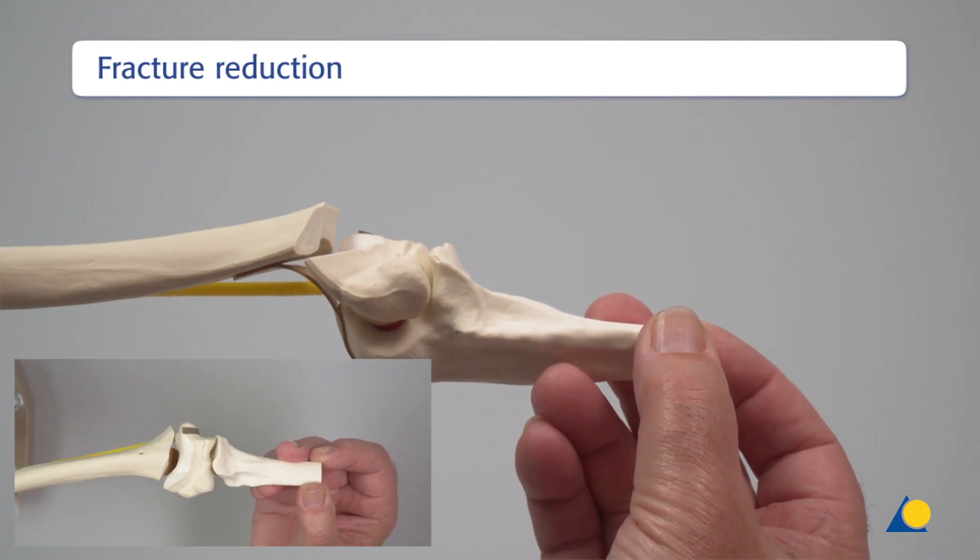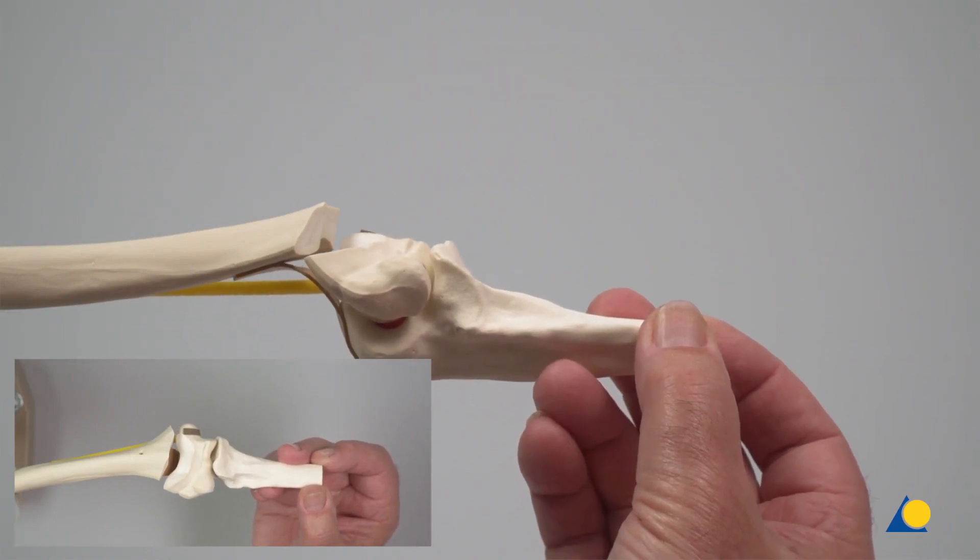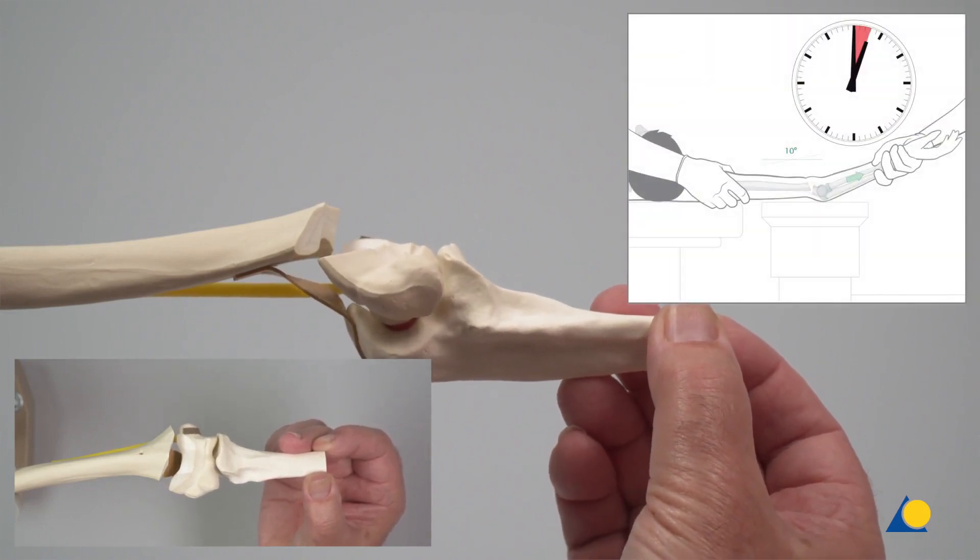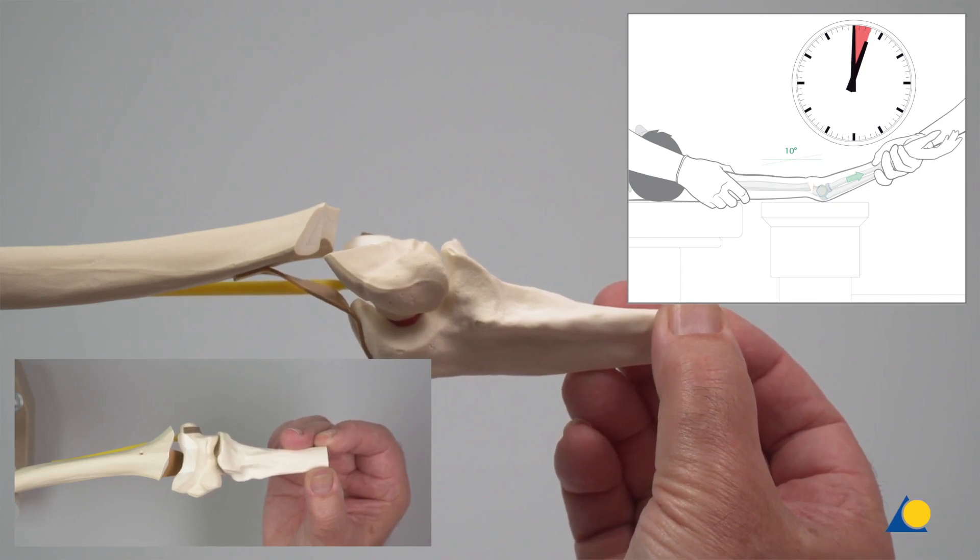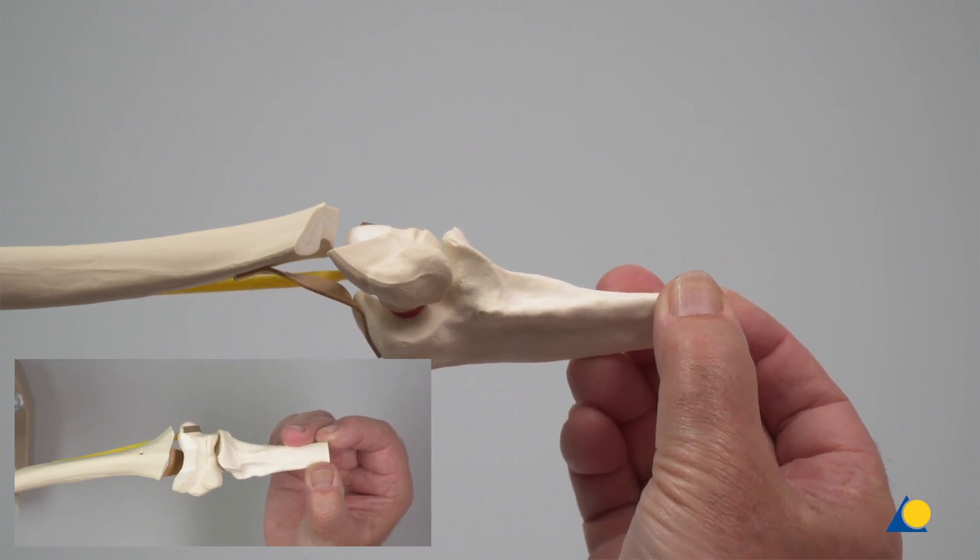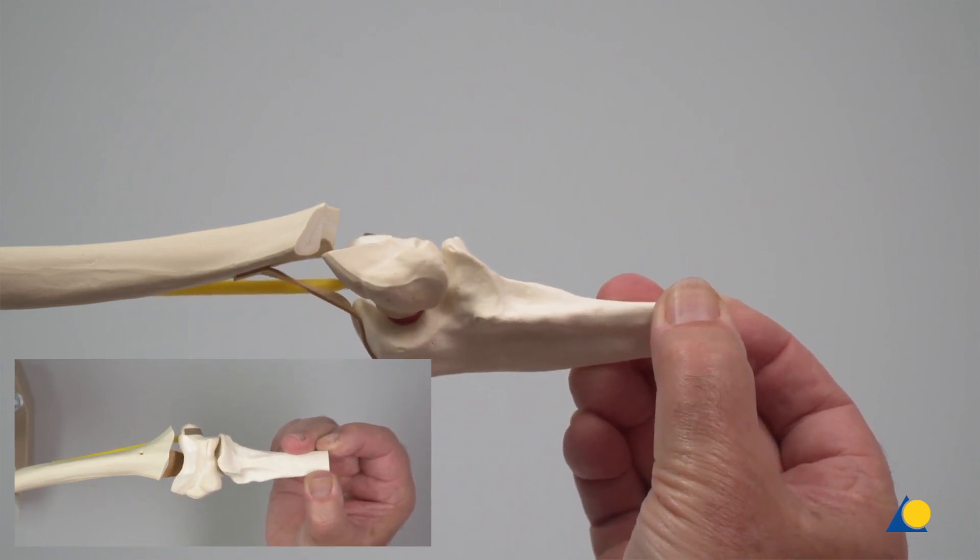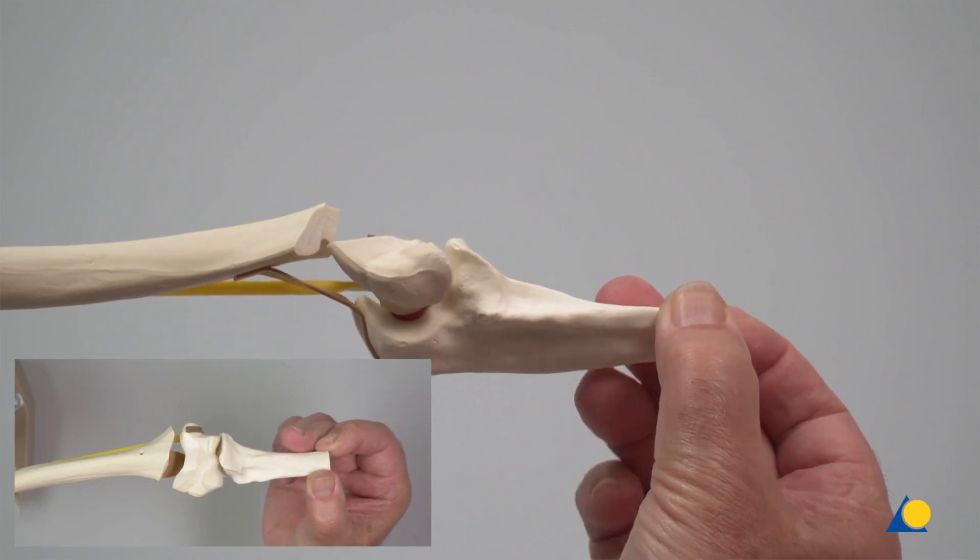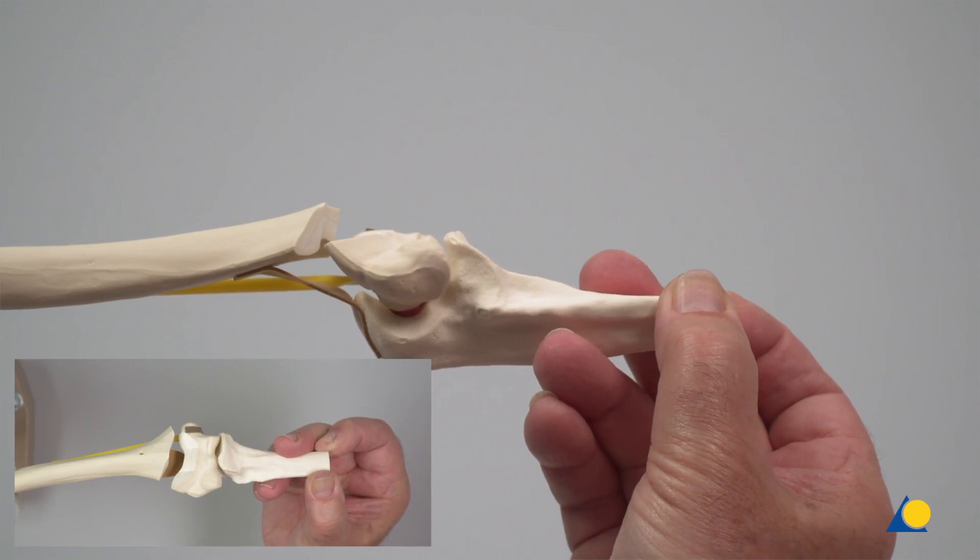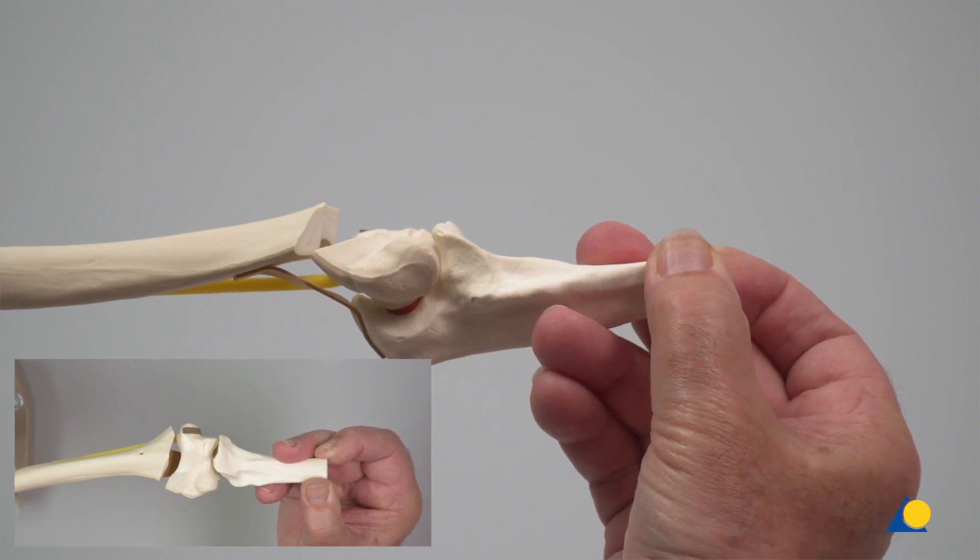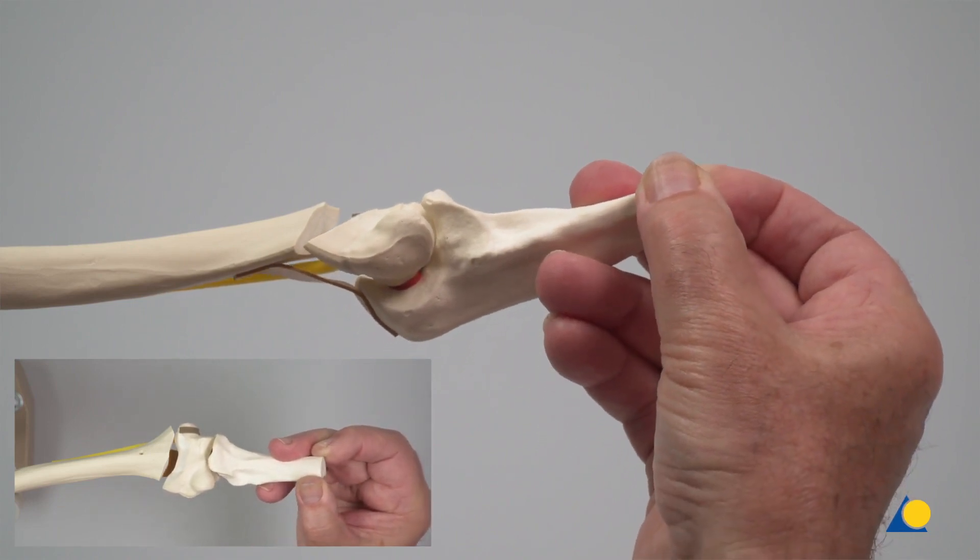In the clinical situation, closed reduction under image intensification would be performed on this type of fracture. With the humerus supported, the forearm along with the distal humerus fragment is pulled for 2 to 3 minutes. The fragment is manipulated in order to fully detach the fragment from the surrounding injured muscles and anterior periosteum. With the fragment detached, reduction begins using the intact posterior periosteum as a tension band. The forearm is used as a joystick and is flexed and pronated, thereby reducing the fragment to the metaphysis of the humerus.